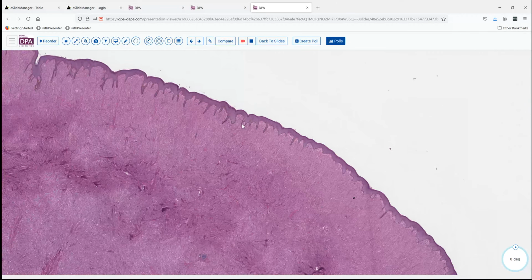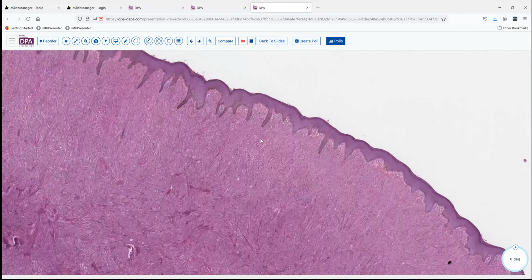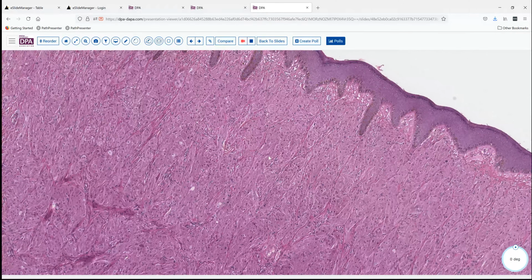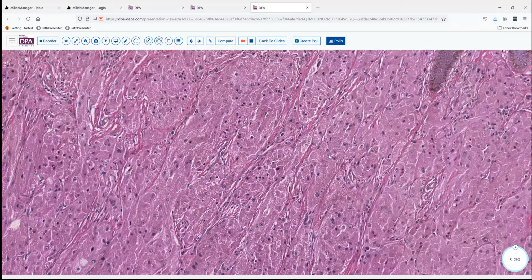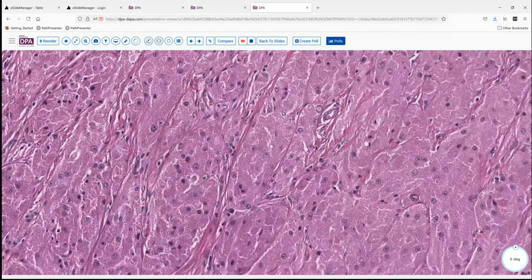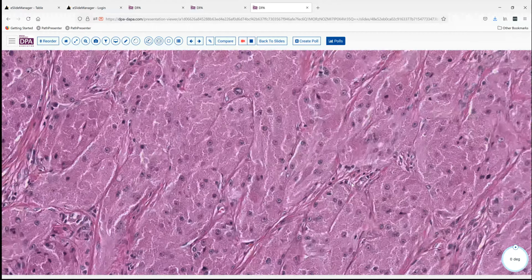So just to round out our presentation, here is another lesion from the skin. As you can see, no particular Grenz zone here, but the nice characteristic morphology with packeting of these cells, sort of amphophilic, very granular cytoplasm, and uniform round nuclei, very small nucleoli here and there, no mitotic activity, and not much pleomorphism.